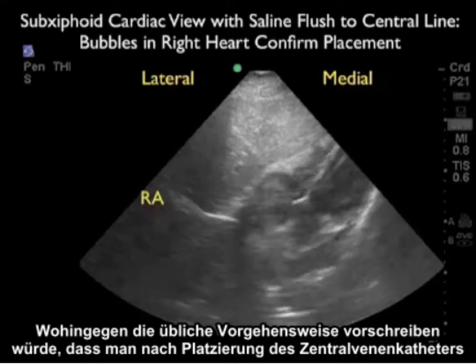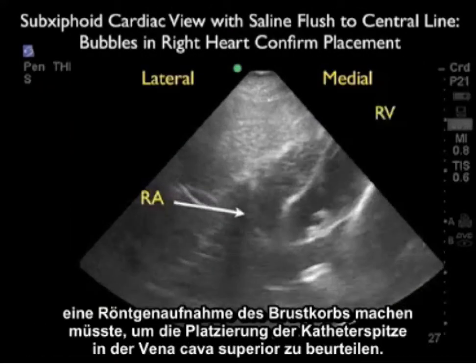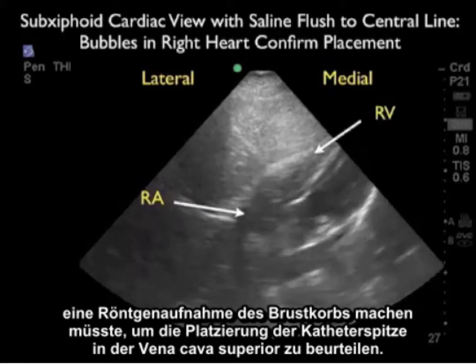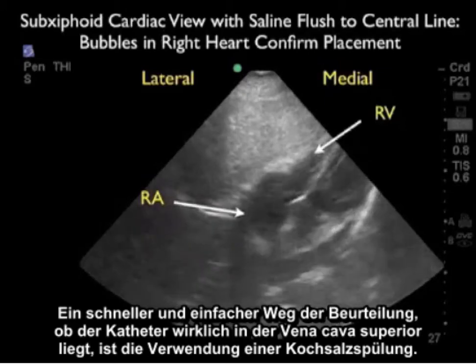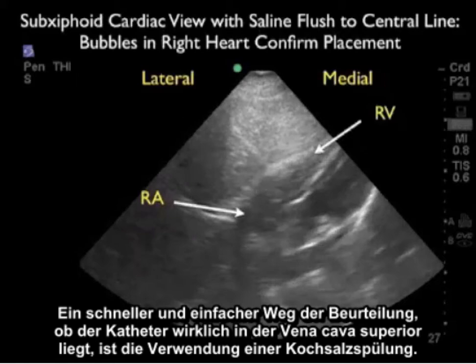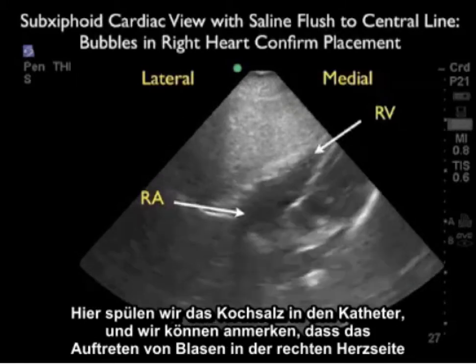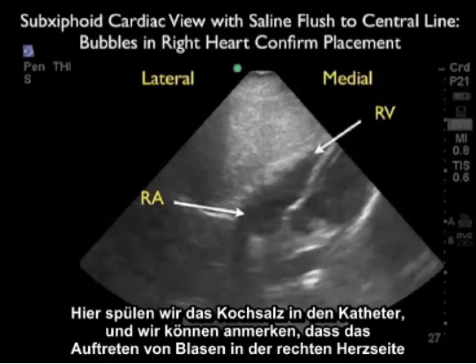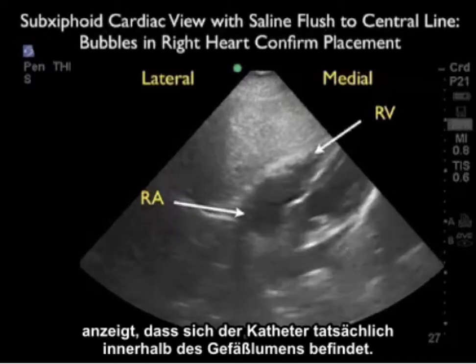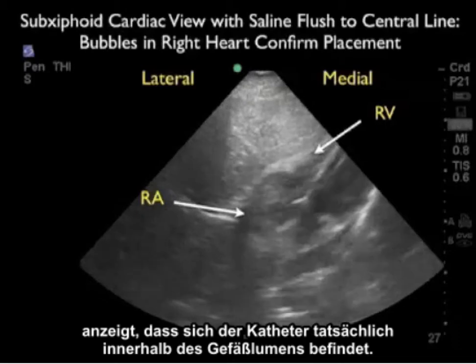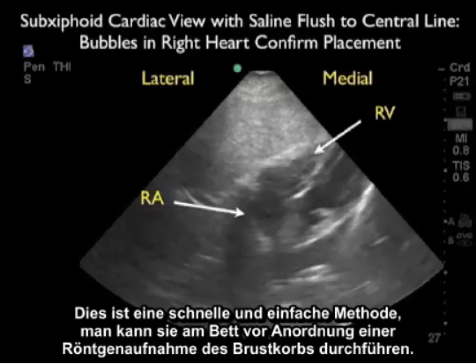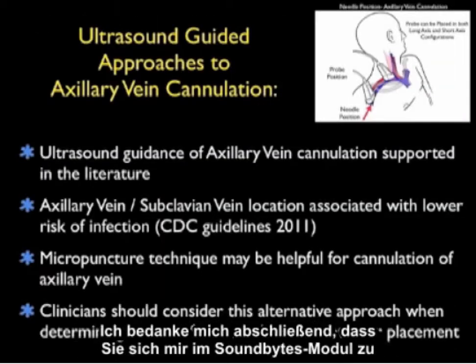While standard practice calls for a chest radiograph after central line placement to confirm catheter tip position in the superior vena cava, a quick bedside method is to use a saline flush. Flushing saline into the catheter, we can note the presence of bubbles within the right side of the heart on ultrasound, confirming the catheter is within the vessel lumen — a rapid verification prior to obtaining the chest radiograph.